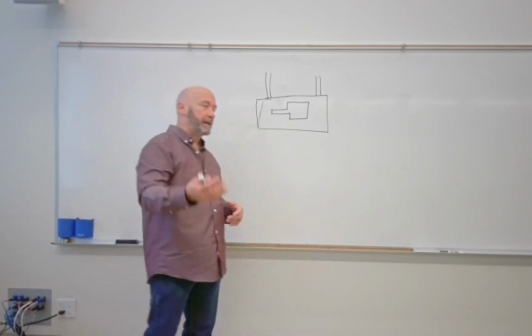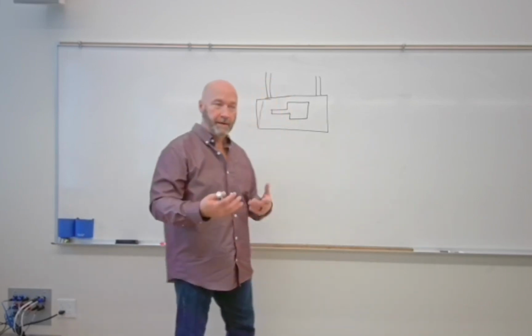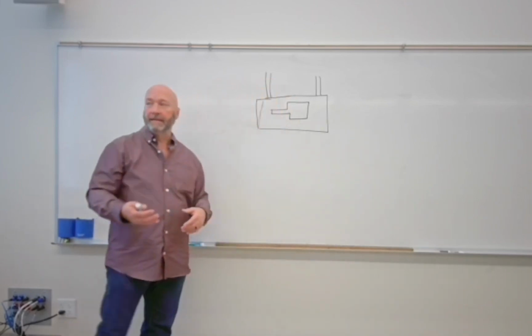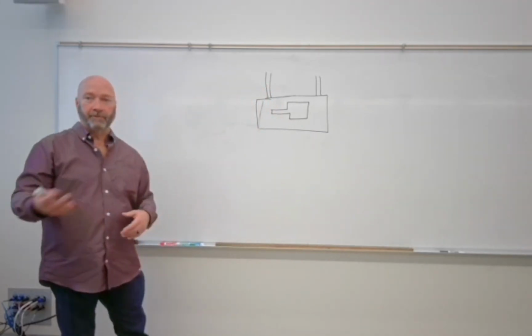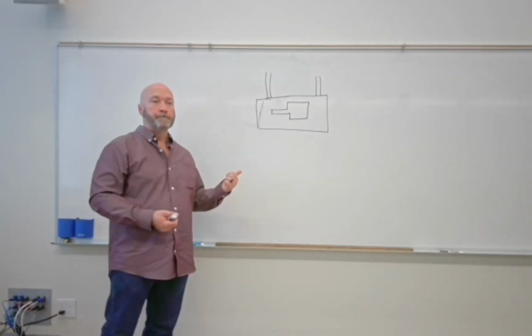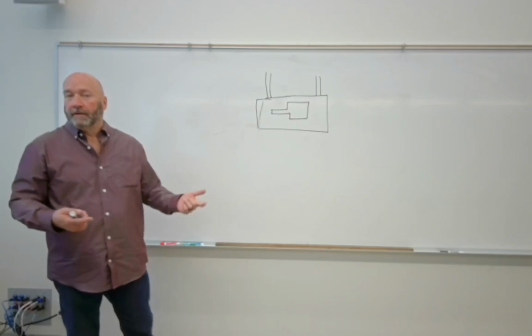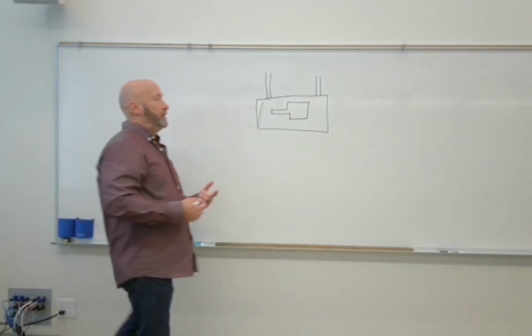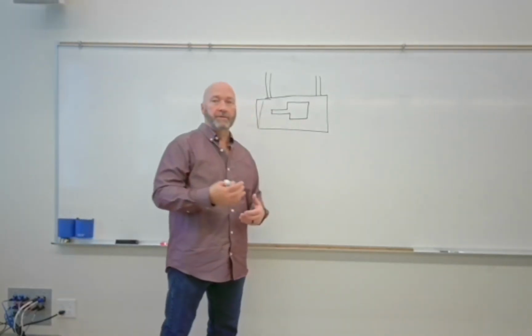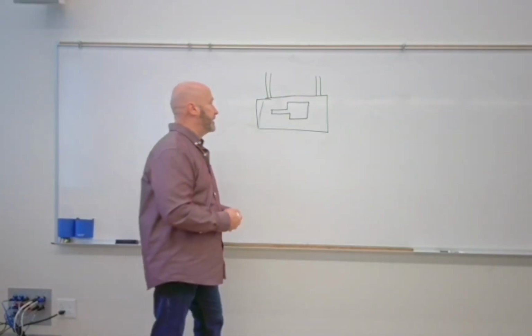Because we're going to run a lot of electricity through the X-ray tube, anytime we send electricity through a circuit, we're going to create two things. That's a magnetic field, and the second is heat, right? So the creation of X-rays is just conversion from electric energy into electromagnetic energy, right?